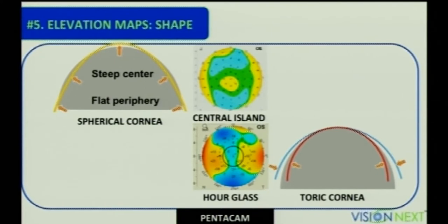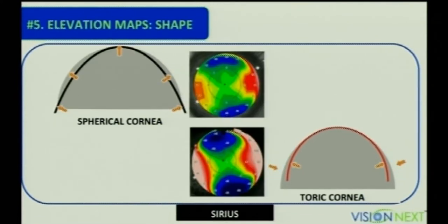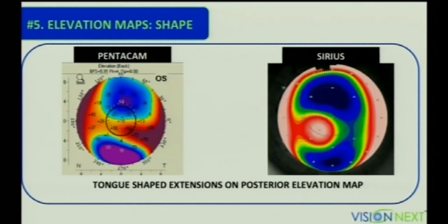Elevation maps show points on the cornea that are above or below a best-fit sphere. In Pentacam, a normal spherical prolate cornea will have a steep area in the center rising above the reference plane, flattening in the mid-periphery, and again steepening in the periphery — a central island pattern. A toric cornea will have the steep axis falling below the reference and flat axis rising above, giving an hourglass pattern. In Sirius, the reference is automated so that the apex of the reference matches the apex of the cornea, giving an hourglass pattern with approximately zero value in the center.